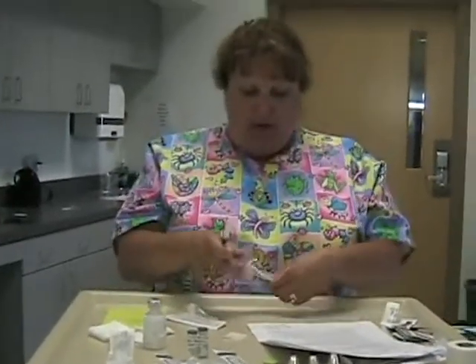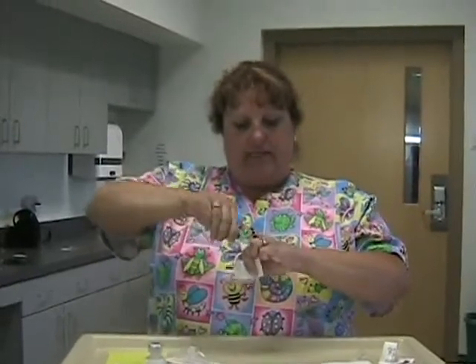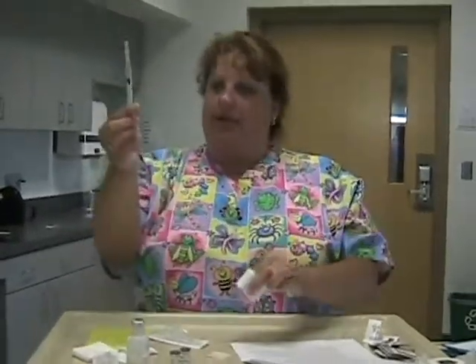We go ahead and open our next needle, disconnecting this without contaminating. Go ahead and screw this on, and now you're ready to take this in to your patient's room, which we're right here anyway, and to give this to your patient. Please keep in mind you will discard this needle into the sharps container in the room.